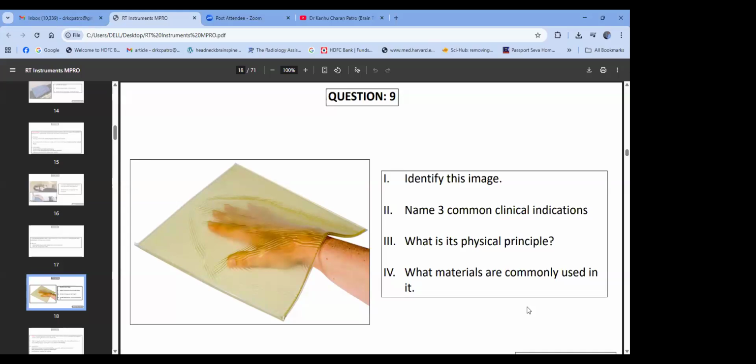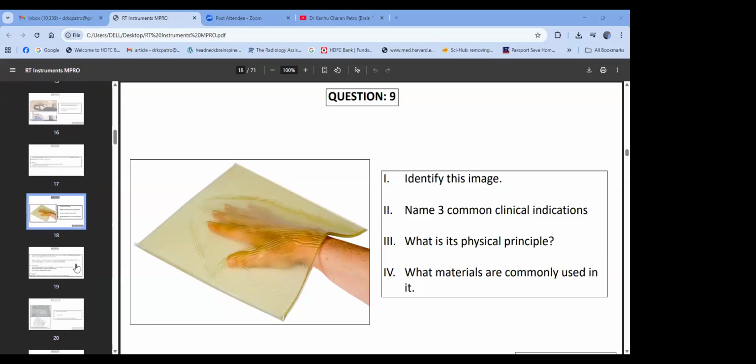The three most common indications are post-mastectomy chest wall irradiation, skin involved or cutaneous metastasis, or to boost scar or surgical flap regions. Materials most commonly used are superflab, paraffin wax, wet gauze, thermoplastic gel, or 3D printed bolus.